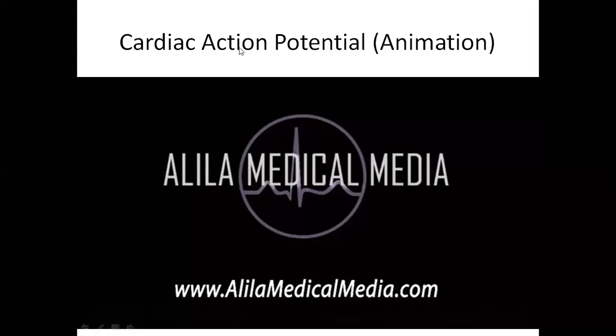So here this pacemaker generates. What I mean is, inside the pacemaker, what is there? A battery will be there and a pulse generator will be there. So it will generate a continuous pulse so that the heart can operate in its normal way.